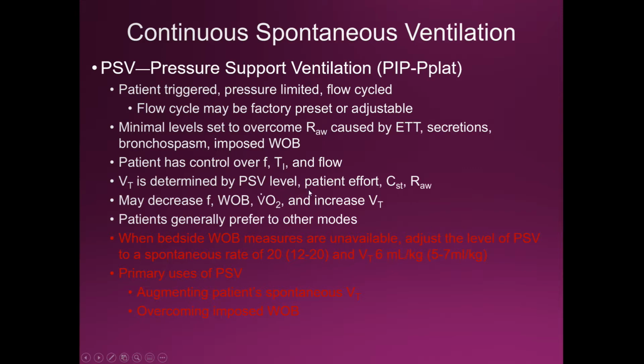When we start looking at this, we start looking at BiPAP. And BiPAP, the difference between the IPAP and EPAP, and I'll have to go over this with you guys in lab later on. The difference between your inspiratory positive airway pressure, your IPAP, and your EPAP, which is your expiratory positive airway pressure. And to keep things in the same context, EPAP is the same as PEEP, is the same as CPAP.